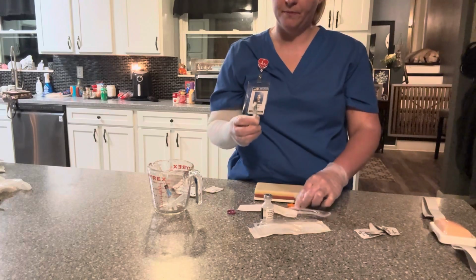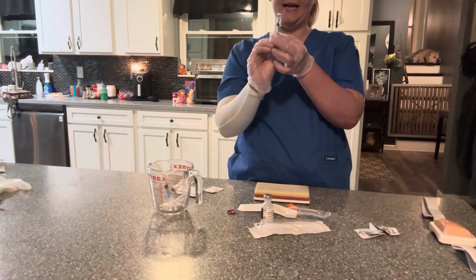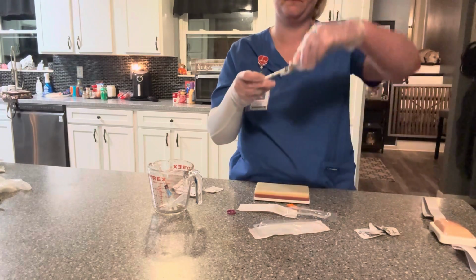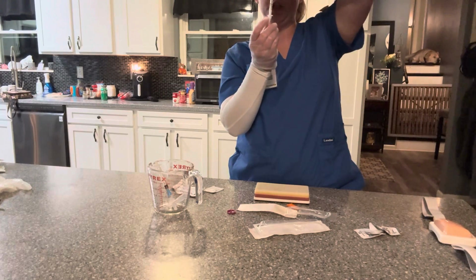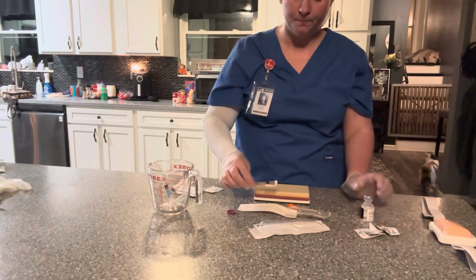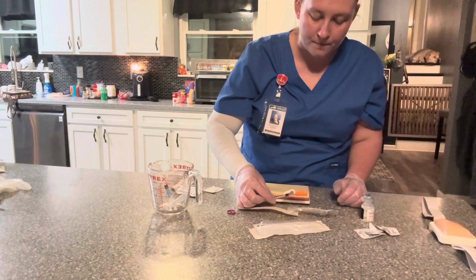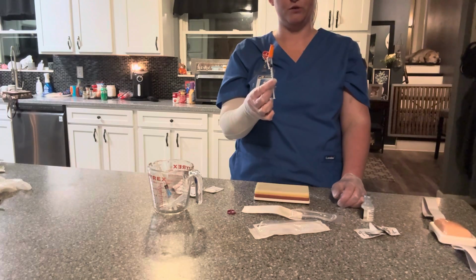Remove my cap. Draw up the correct amount of air for the amount of medication that's going to be given. Inject the air into the vial. Pull up my medication, ensuring that there are no bubbles in the syringe. I would not recap my needle. I would scoop the cap up that is lying on the table for the correct transportation of the medication and the needle to the patient's room.